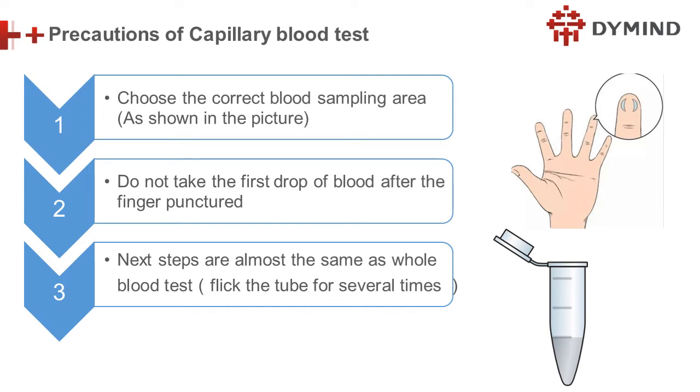So the other steps are the same. Only the first two steps are different. So we use the glass tube to collect and push. If you want to know more details, actually we have a video. So later I will show a video for the blood collection. Okay.